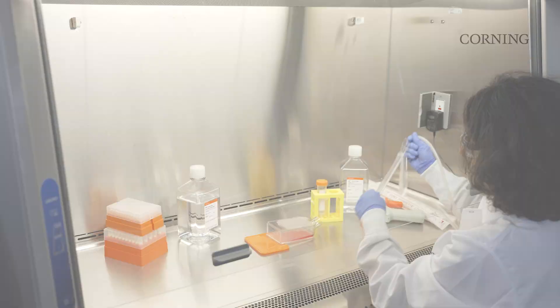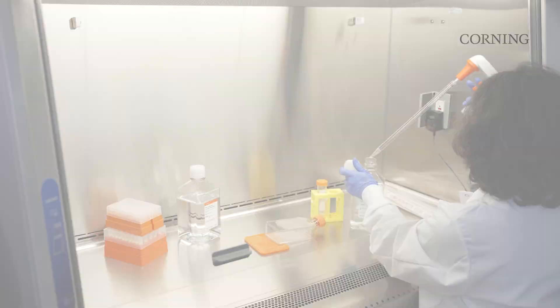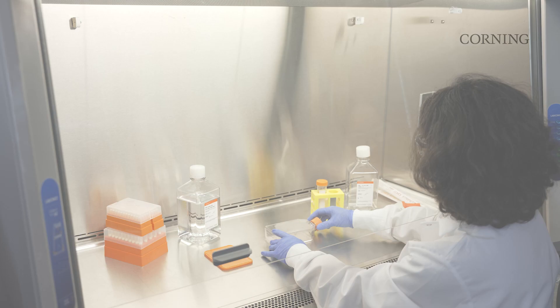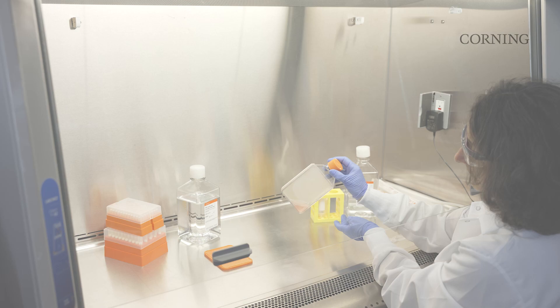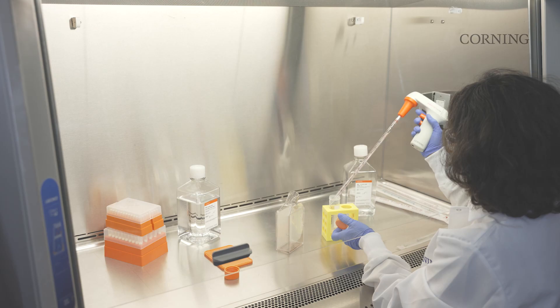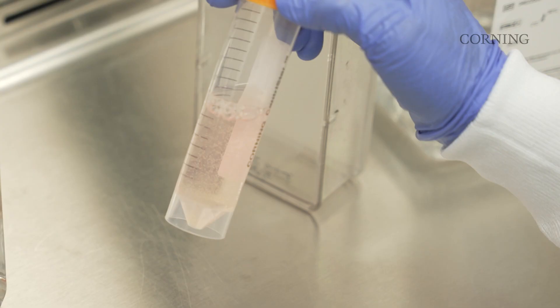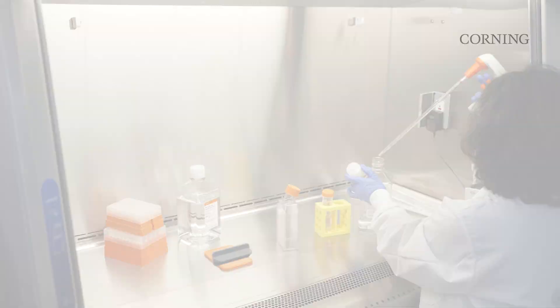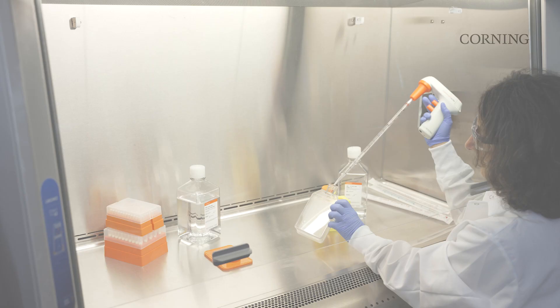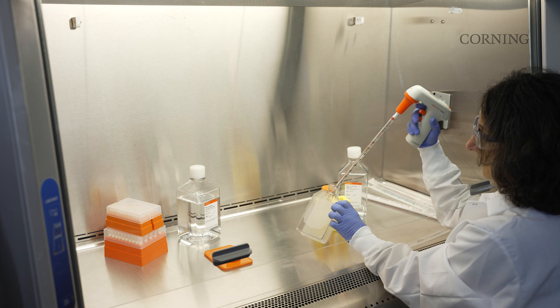For spheroid collection and harvest, remove spent medium, then add the desired collection solution and gently tip, tap, and swirl the flask to dislodge spheroids from the micro cavities. Bring the flask to the upright position to release the spheroids from the micro cavities and prevent them from resettling. Spheroids can be collected and transferred to a separate collection container. It may be necessary to perform additional rinses of the micro cavity surface with fresh collection solution to recover all spheroids. A back-and-forth windshield wiper motion against the growth surface is recommended to rinse the spheroids out.